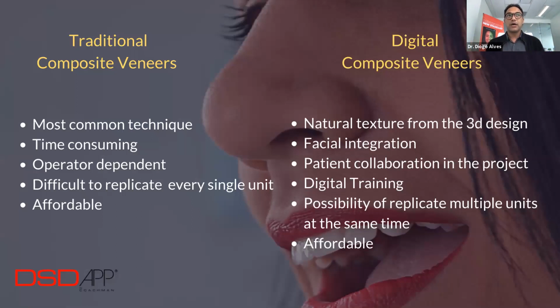Usually, when I use the entire digital workflow, the procedure itself for about 8 to 10 veneers takes about 2 hours, which is not a lot compared to doing 8 to 10 veneers manually in the traditional analog way. Another benefit of digital composite veneers is that you can have the patient's collaboration in the project, and I will show you later how that works.